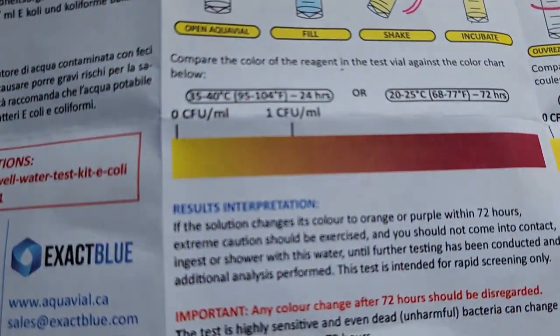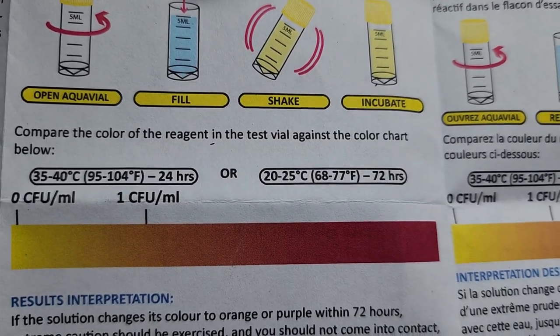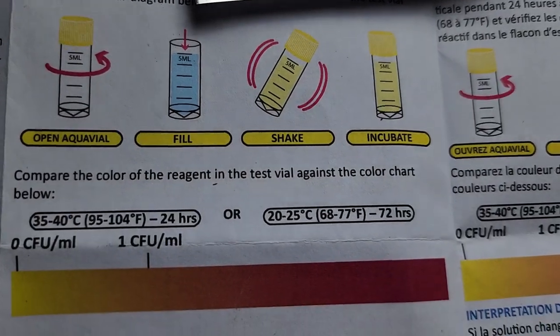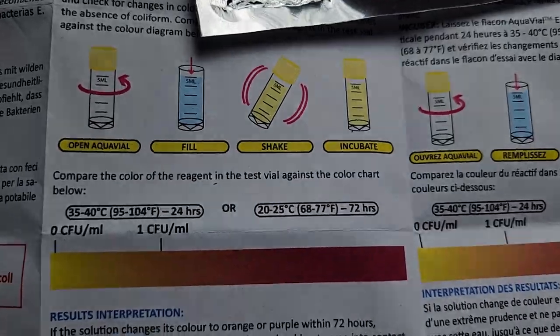We need to come up with anything red to see if there's an issue. It says at 68 to 77 degrees, we have to pretty much let this sit here for up to three days, 72 hours, before we get a real result.